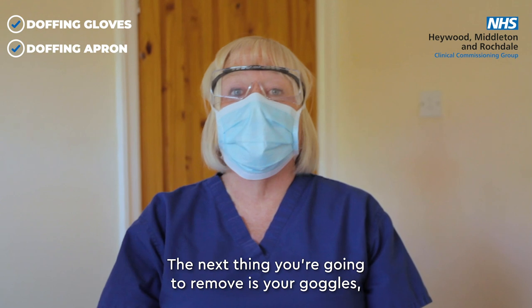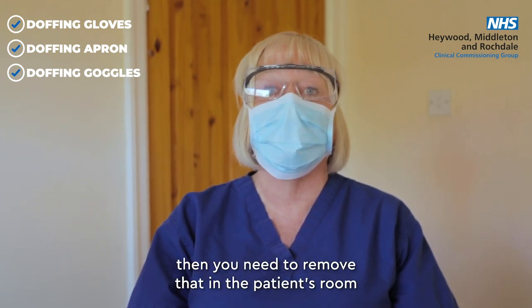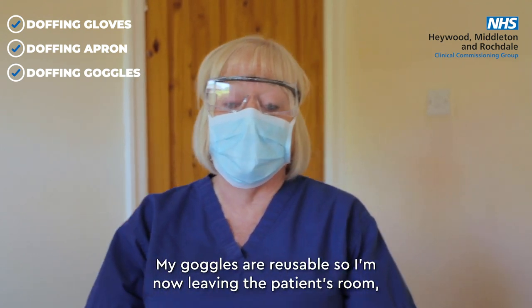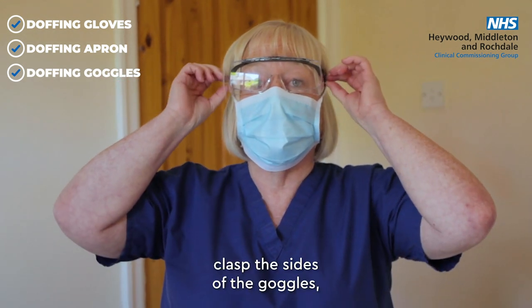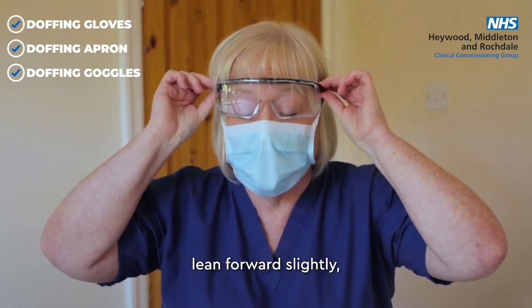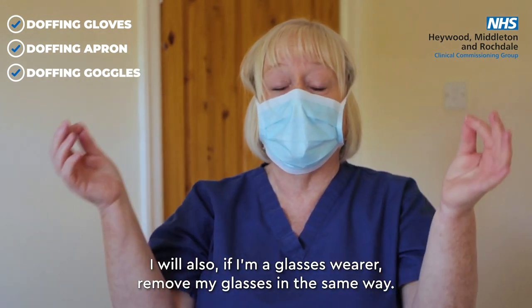The next thing to remove is your goggles. If you're wearing disposable goggles or a disposable visor, remove them inside the patient's room and dispose of them in your clinical waste bag. My goggles are reusable, so I'm now leaving the patient's room to remove them outside. Raise your hands, clasp the sides of the goggles, close your eyes, lean forward slightly and remove the goggles, then place them on a clean surface to be cleaned later. Glasses wearers would remove their glasses in the same way.